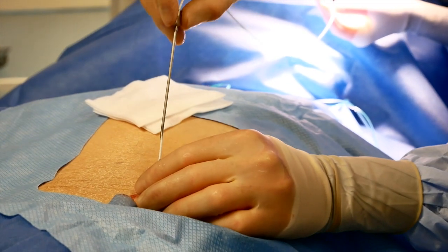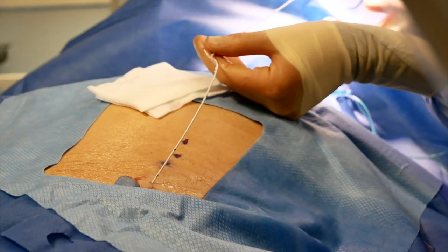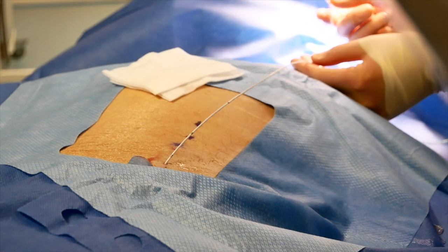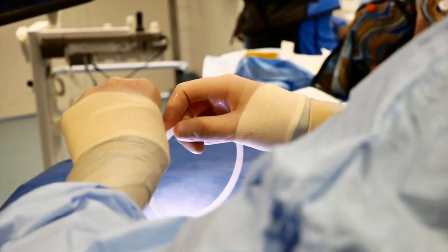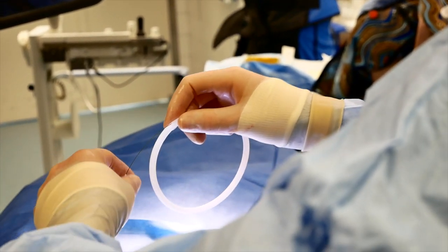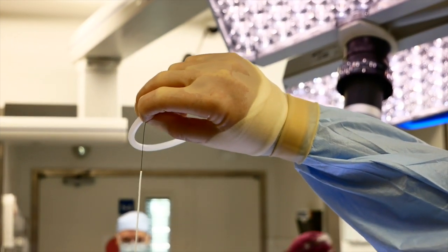Once an attempt is made to advance the catheter, the catheter should never be withdrawn, given the risk of shearing the spinal catheter. If a rigid guide wire is used, it should be withdrawn by applying constant light traction.